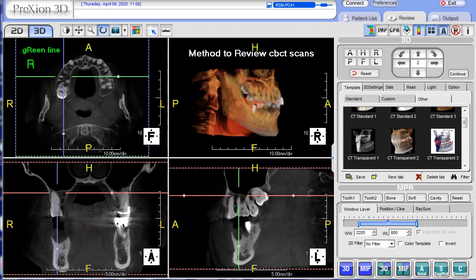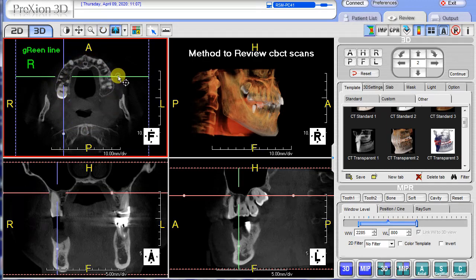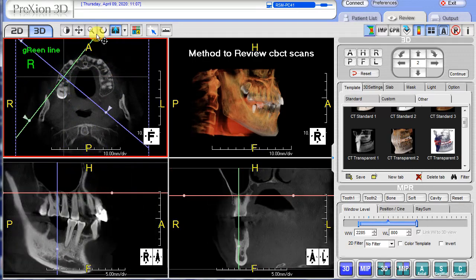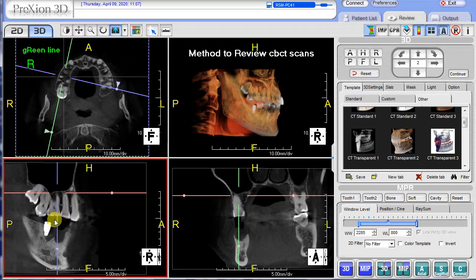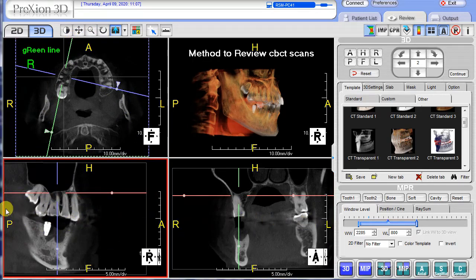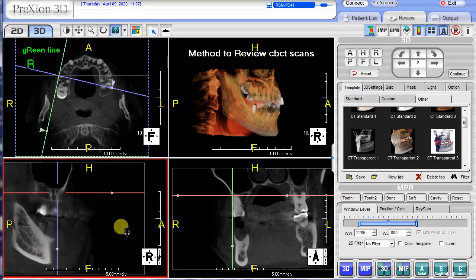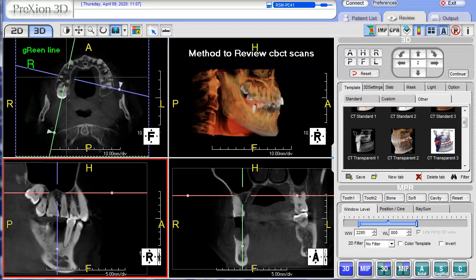Now we want to align the green line here in axial on the right side. Grab your target point or anchor point and drag this green line up and parallel to the right side of the arch. When you release it, you can see this becomes your sagittal screen and this is your coronal screen, so you get a better view of all the teeth aligned on that right side. Scroll — remember green line, right side.